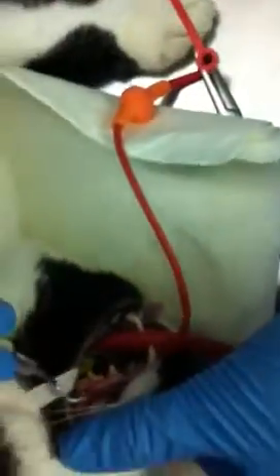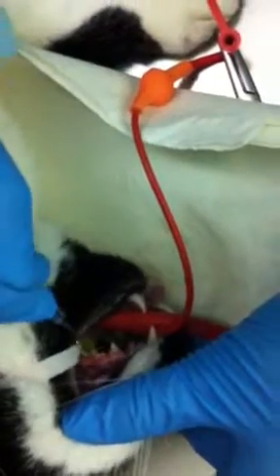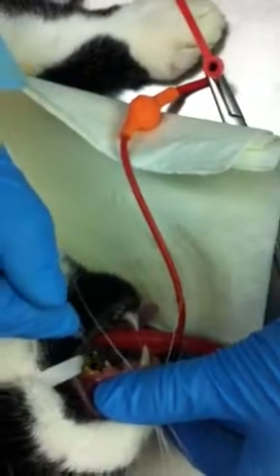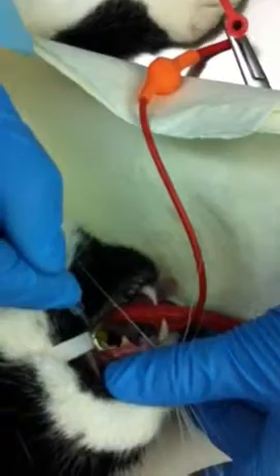We've got to get right in here. We're just removing some of this tartar and plaque. You can see that there is a little bit of gingivitis as well associated with these teeth and inflammation.